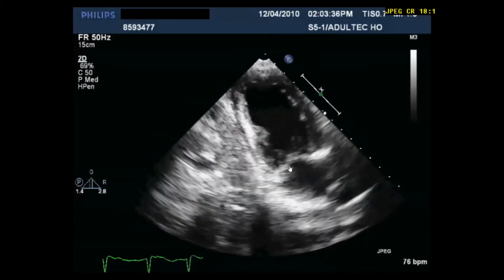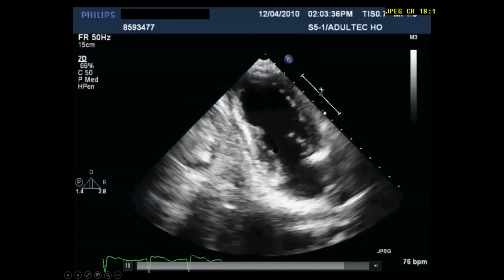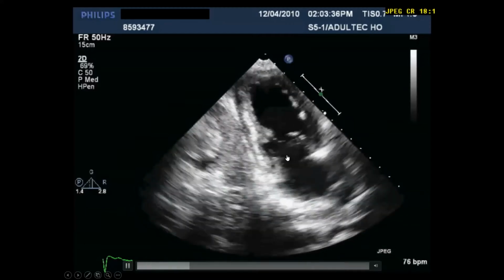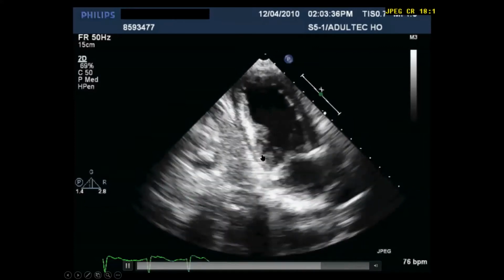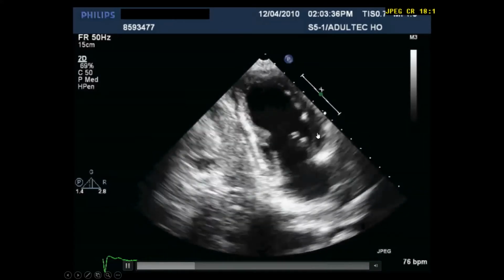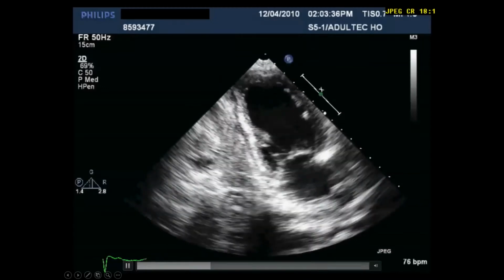Yeah, the mitral valve is a bit crowded and there is some laxity of the cord here, but there is no clear rupture cord I could see here. But try to focus on the LV wall motion itself, anterior and inferior. Inferior. Okay. Yes, exactly. You are so right.